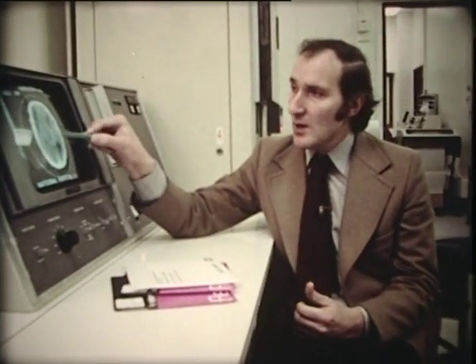To show this before the advent of CT would have meant carrying out cerebral angiography with injections of rather toxic substances into the arteries leading to the brain. But here, very quickly and easily, within 10 minutes of the patient coming into hospital, we have the answer.